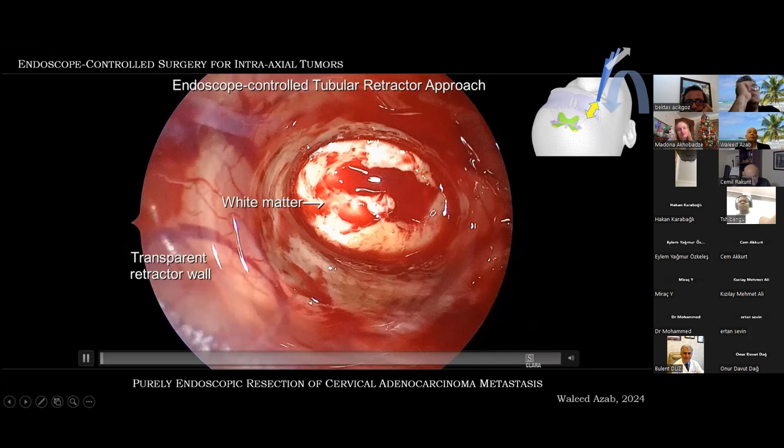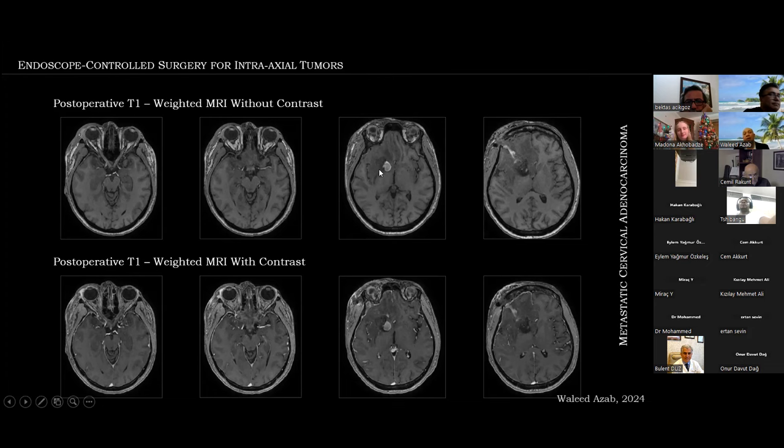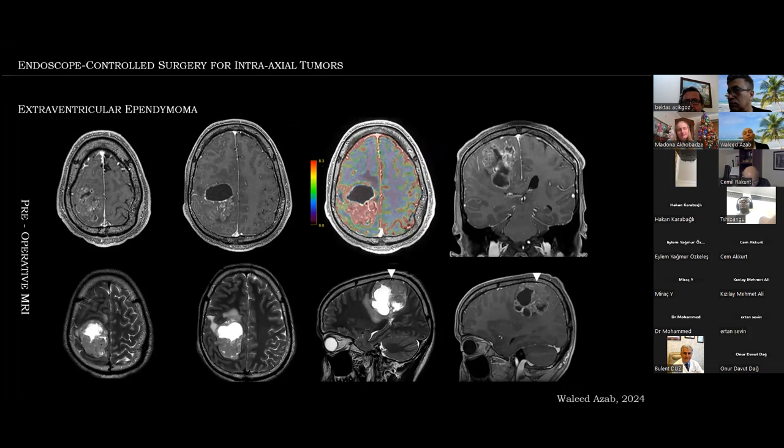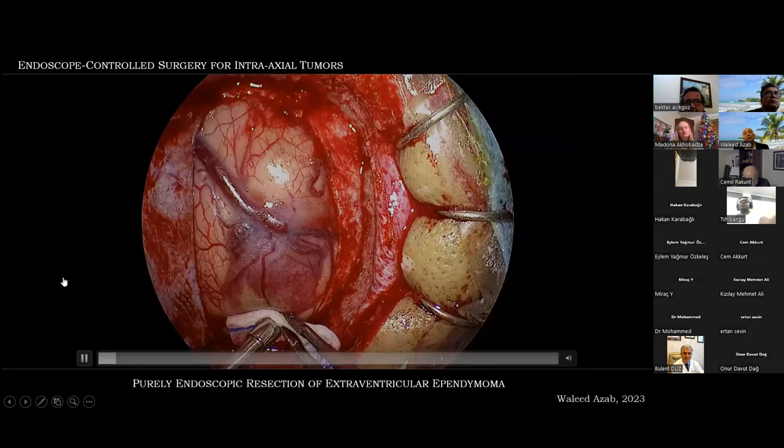Post-operative MRIs with gross total resection. This is a non-contrast MRI and this is post-contrast — just some blood in the cavity, but the tumor was completely taken out. The next example is an extraventricular ependymoma in a 21-year-old male. Note that the endoscope was used in the exoscopic position because of the surface nature of the tumor.